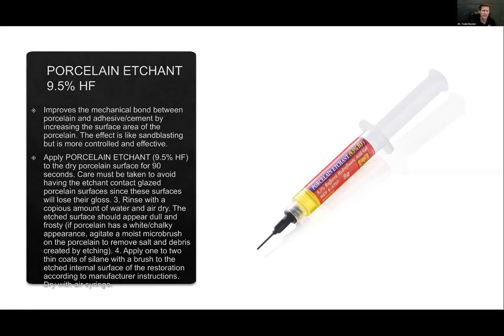After you've etched this properly, you want to rinse that off and dry it. Now, the surface, as I mentioned, should have that kind of frosty look to it, right? We can tell we've gone all the way out to the edges if it's frosty. Hence, you want to be wearing those loops. From there, if the porcelain has a white chalky appearance, you're going to want to agitate that with a moist micro brush to try and drive off that salt debris. You could also take this and stick it in an alcohol or acetone water bath. Me personally, I like steam cleaners. I use those regularly to remove that. From there, you're going to place a silane on it. We'll talk about silanes in just a minute.